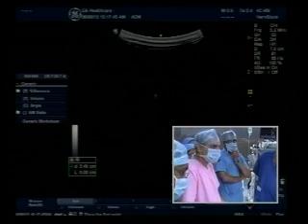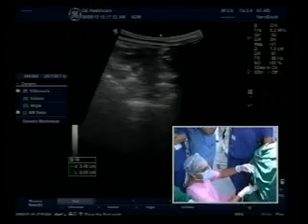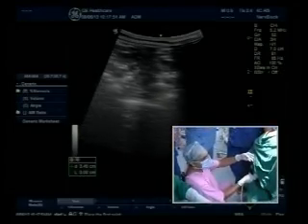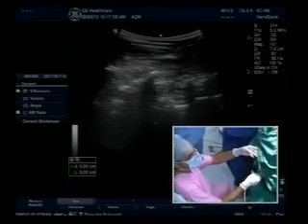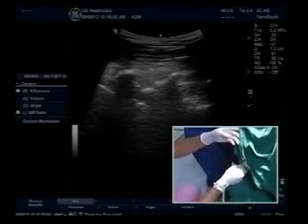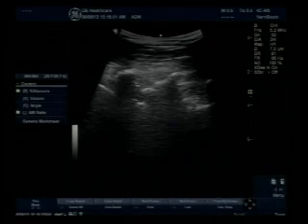My point is that if you have got a clear depth with the midline view, for example here, then I will obviously go in the midline. I will not go paramedian. If I'm going paramedian, then can you just freeze this picture, please? And then please, if you could take the pointer at the ligamentum flavum, yes, that's the ligamentum flavum. So you still can measure the depth, but when you are going paramedian, you really are going completely out of plane, because you are going to take the probe out, and then you don't know which level or which direction you are going.